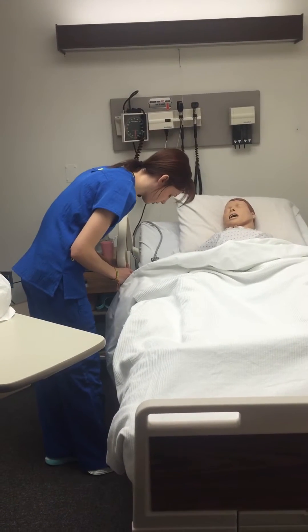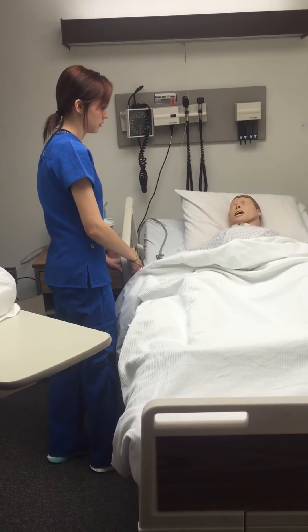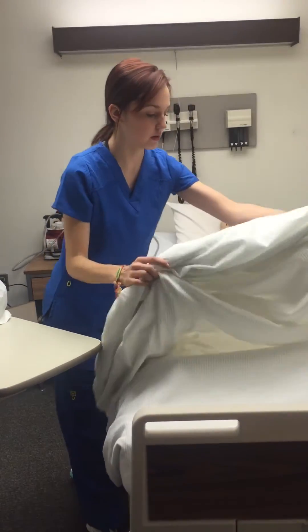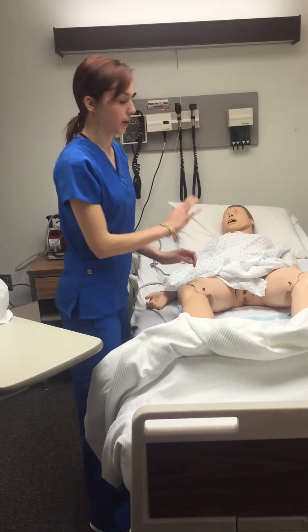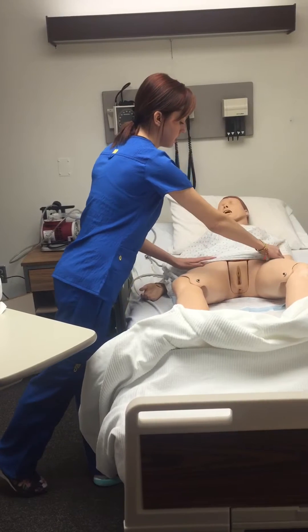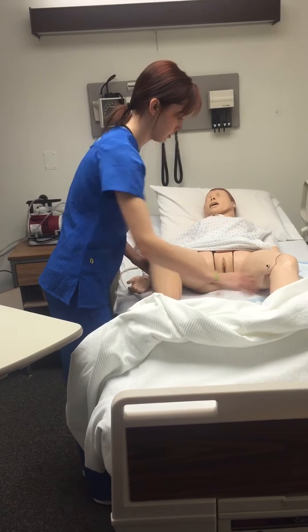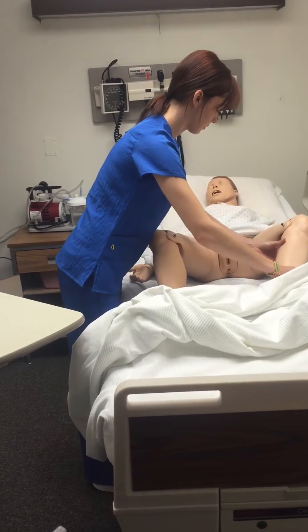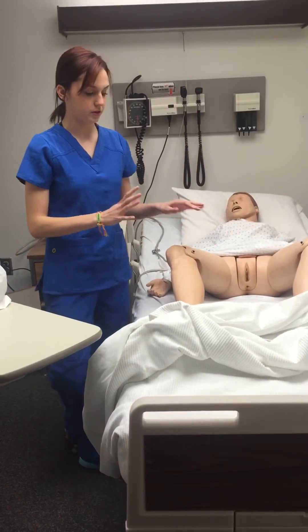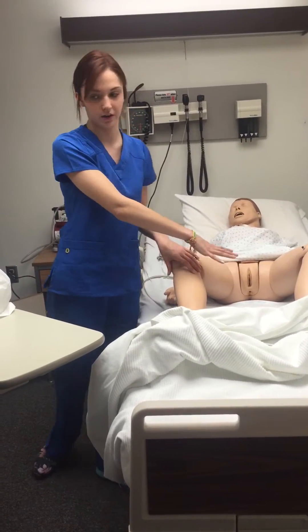I'm going to put her head down a little bit so she's comfortable. I would then bring this down. I would then do peri-cares and then I would remove my gloves so it's clean and I would expose her, and I would ask her to lift her legs like this, and then tell her that once I do the sterile area she cannot move and try not to move as much because my sterile area will be right there.